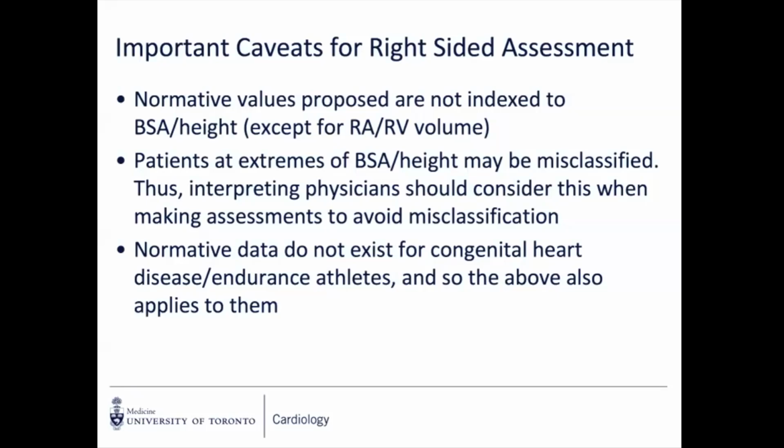And then also, there's not a lot of normative data that exists for congenital heart disease or endurance athletes. And so the above would also apply to them.